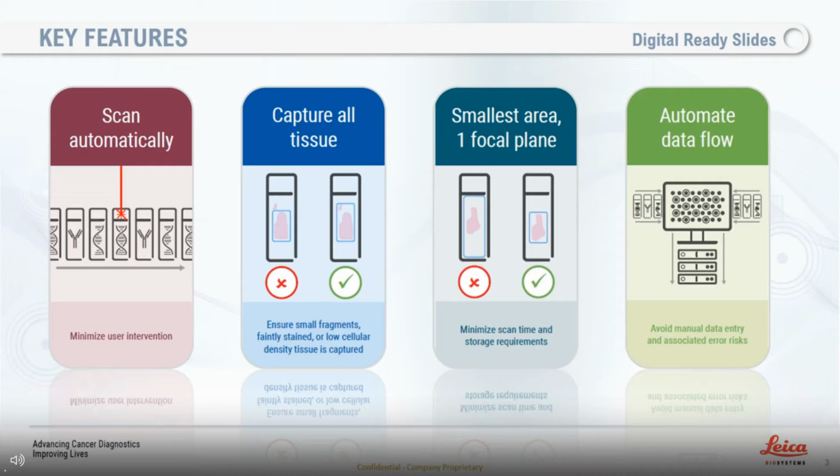The final piece in the key features or attributes of digital ready slides is to automate the data flow. And again, this is with a view to minimizing hands-on time, not sitting there doing data entry, but also to avoid manual data entry and associated error risks.